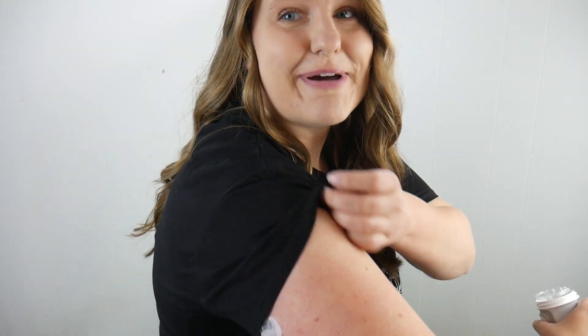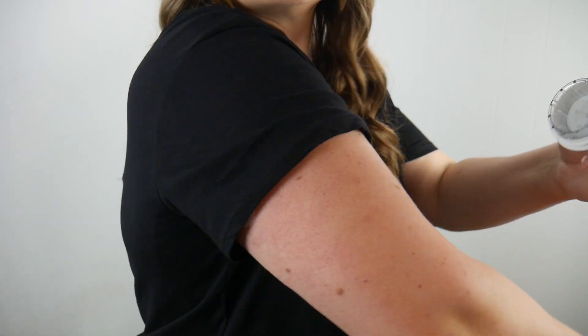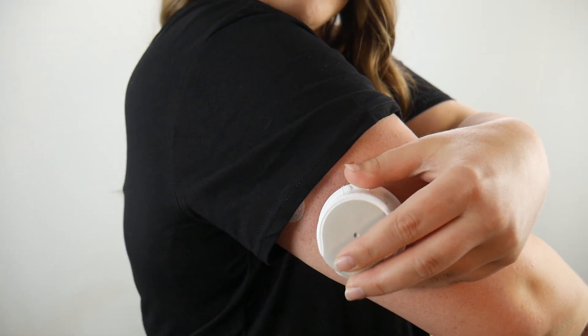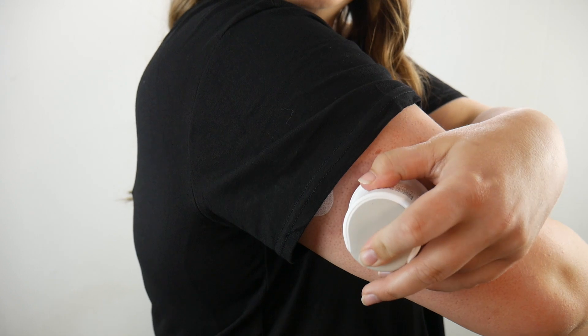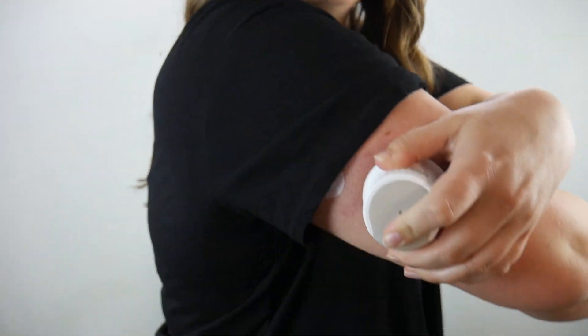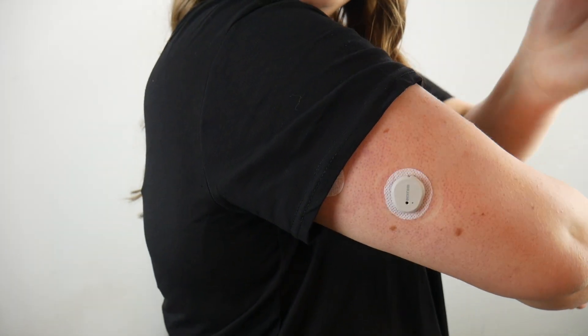Trying to make it so you can see my face too, but it's a little difficult. I'm just going to place it against my arm, about there, push down, and then push the button. One, two, three. Did not feel a thing. Let it stick really good, and take it off.